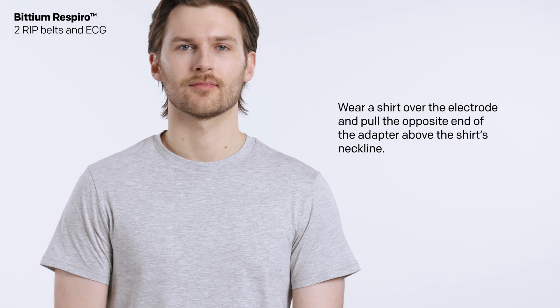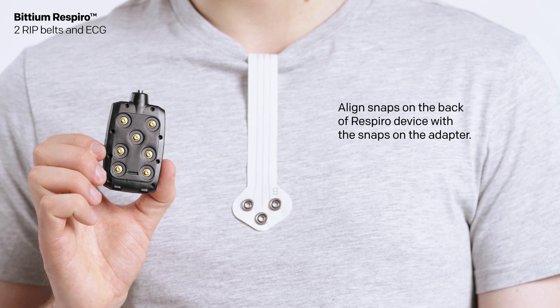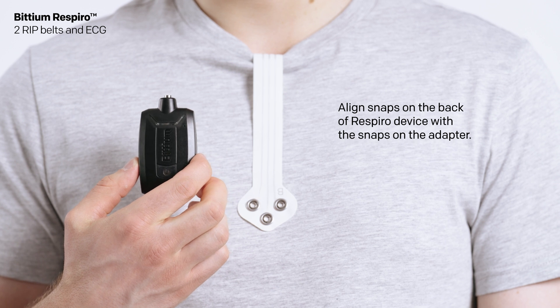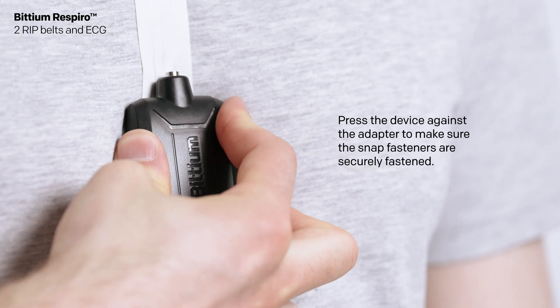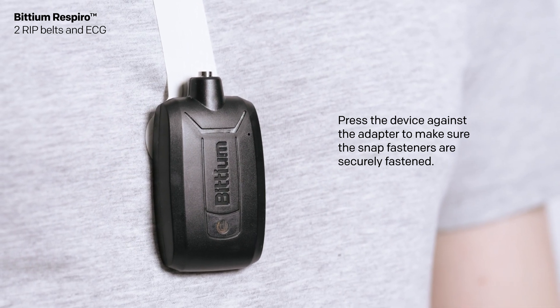Wear a shirt over the electrode. Pull the opposite end of the adapter above the shirt's neckline. Align the snaps on the back of the Respiro device with the snaps on the adapter. Press the device against the adapter to make sure the snap fasteners are securely fastened.